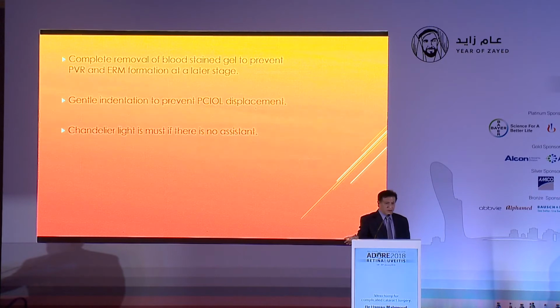It's important to completely remove the blood-stained gel, so I'm quite keen to remove the peripheral vitreous. However, gentle indentation is required because a PCIOL can be dislodged. And a chandelier light is a must if there's no assistant.